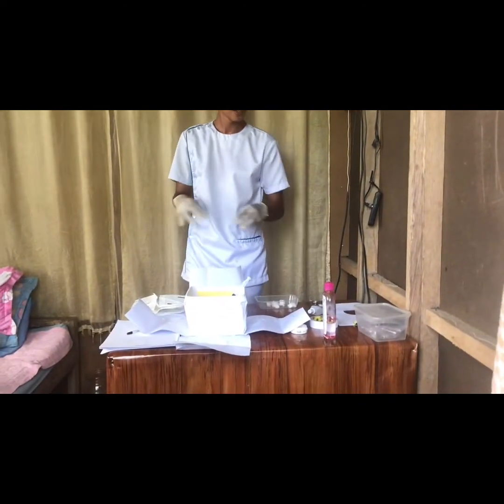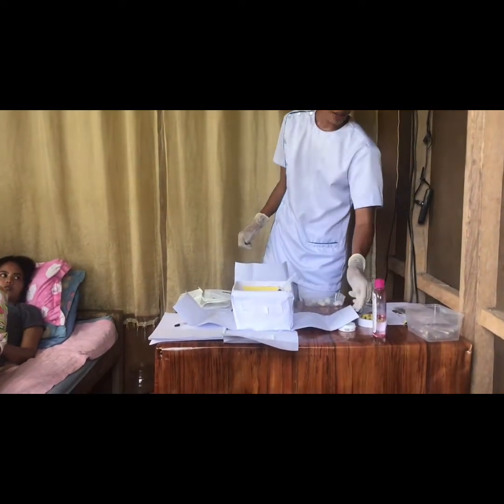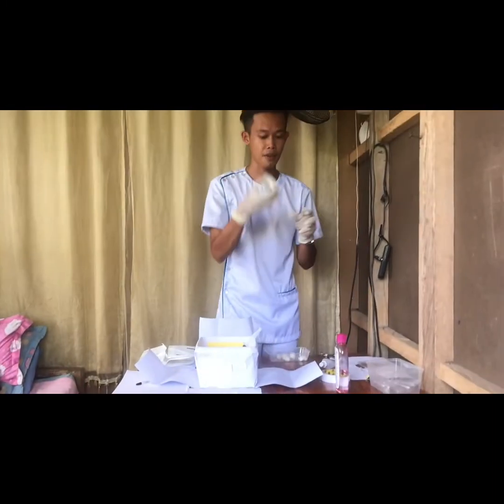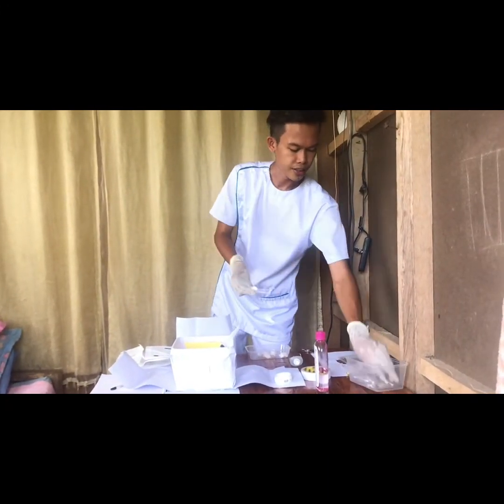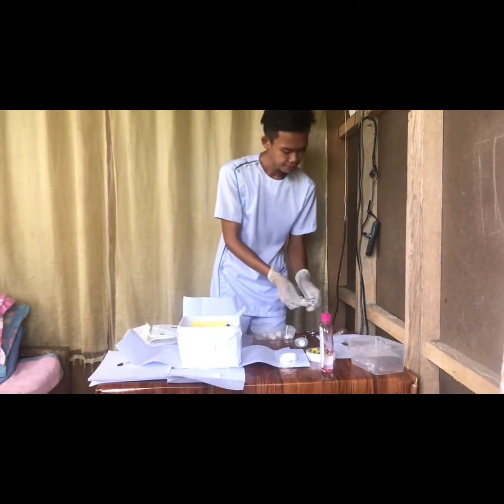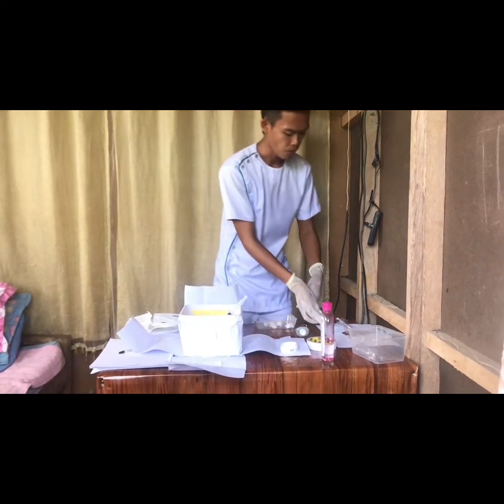On the other hand, I'm going to prepare the alcohol swab, and also we have this lubrication spray. This is a lubrication cup, and then we have the lubrication spray. And I'm going to take 3 of the alcohol swabs here. And then I'm going to open them one by one immediately.